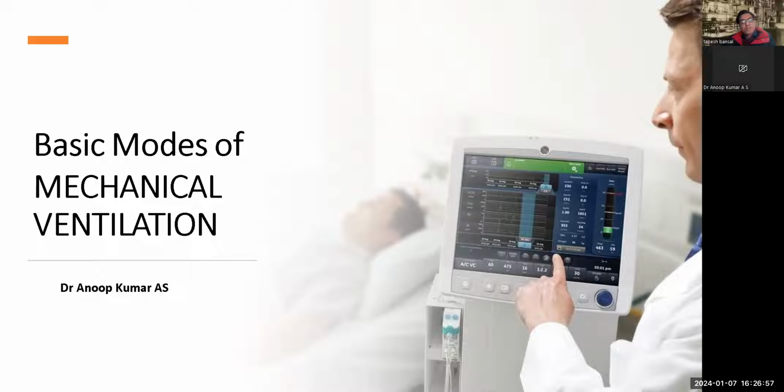So today we'll be concentrating on basic modes of ventilation, where we'll be discussing the different modes of ventilation. Maybe in a later session, we can have discussions on different case scenarios. As you are aware, we'll be ventilating mainly three types of patients. One may be with a normal lung. We may be intubating them for non-pulmonary reasons, like they may be having a decreased sensorium or muscle weakness, etc. So that is one group of patients.